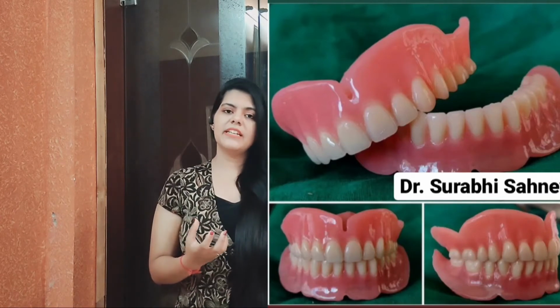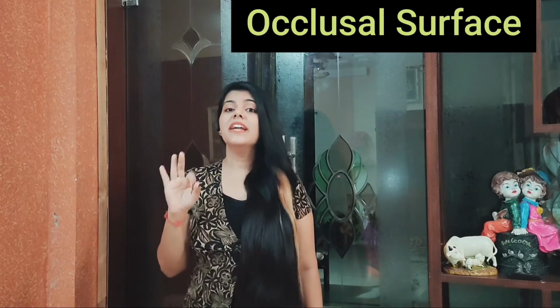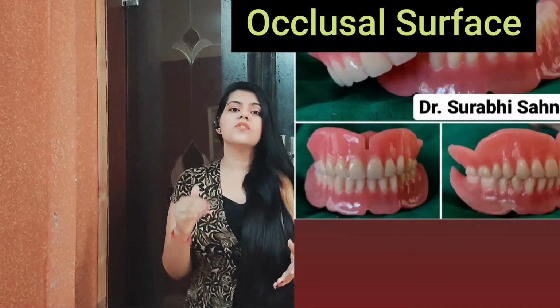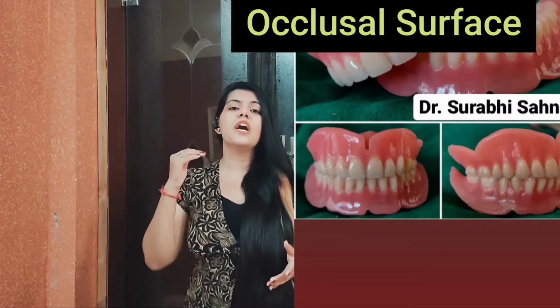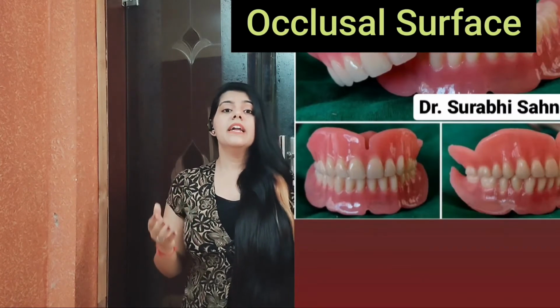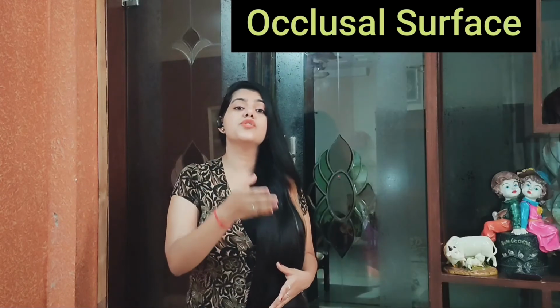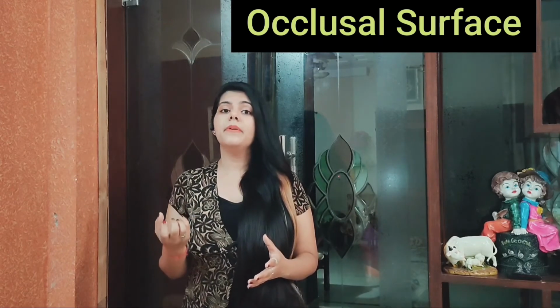Food debris will accumulate and that can lead to any kind of infection in the denture. Now begin with the third surface, that is the occlusal surface. It is defined as that part which includes the occlusal surface of the denture teeth which are in contact with the occlusal surface of the opposite denture teeth. It basically includes the denture teeth which resemble that of the natural teeth. Its main function is that it provides aesthetics and helps in the mastication of the food.